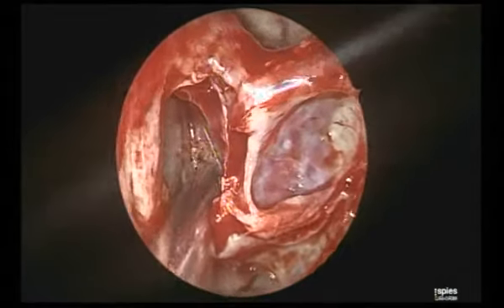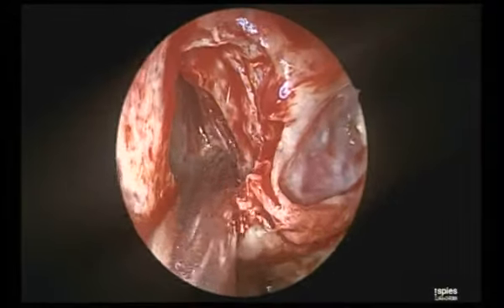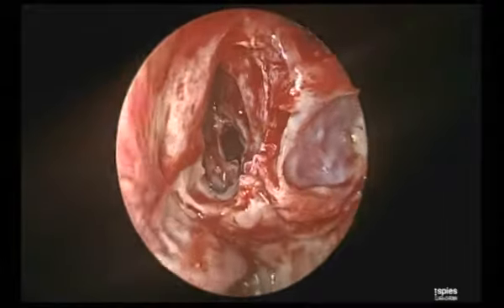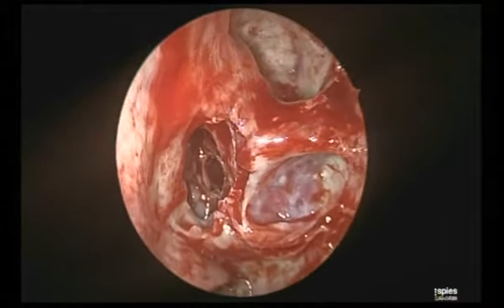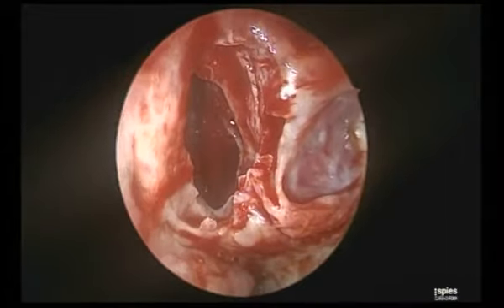And see now what I have opened. Can you see? Very nicely. That is the sphenoid ostium. Now, that's the superb landmark for me. So I can carry out now my posterior ethmoidectomy confidently without any issue. The only thing I need to be careful is not to go behind the level of the sphenoid ostium.